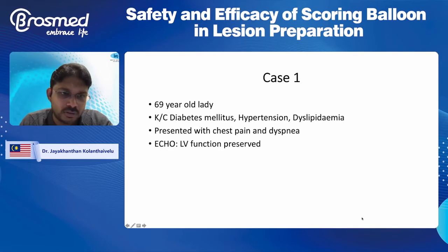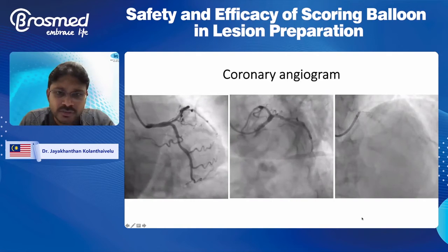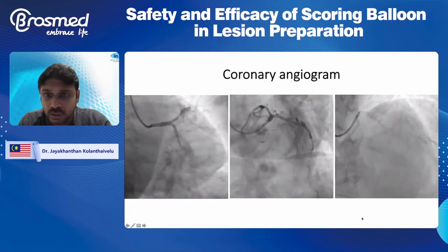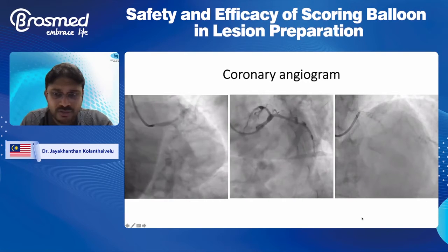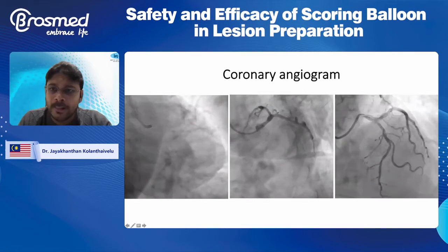I have the first case, a 69-year-old lady, diabetic, hypertensive, dyslipidemia. She presented with some chest pain and dyspnea. LV function was preserved. If you look at the coronary angiogram, she's got severe disease in the ostial LAD, and we could argue that maybe you can stop at the ostium, but because there was some disease in the body of the left main, and IVUS essentially proved that as well, we felt that we have to go to the ostial.